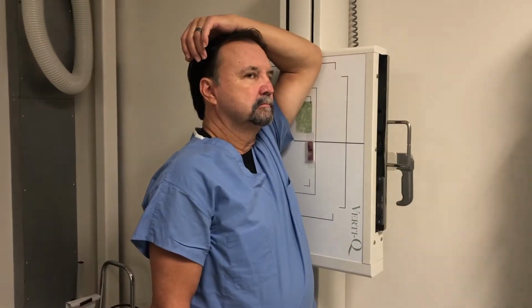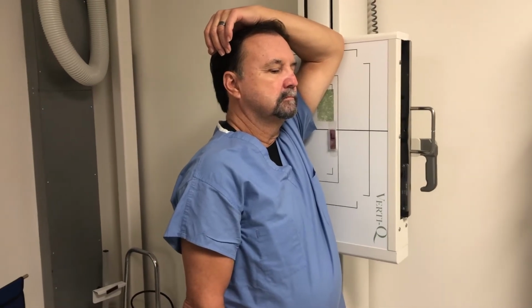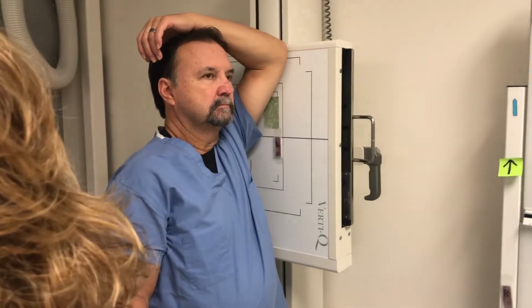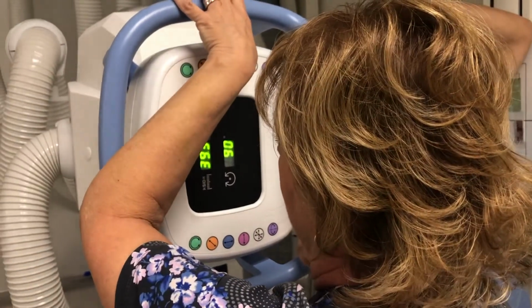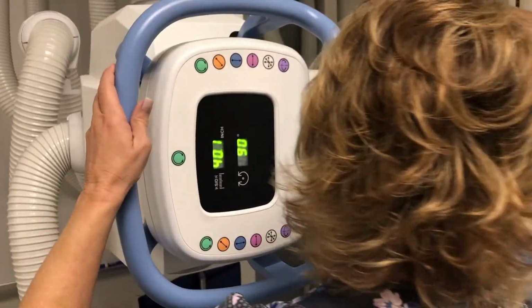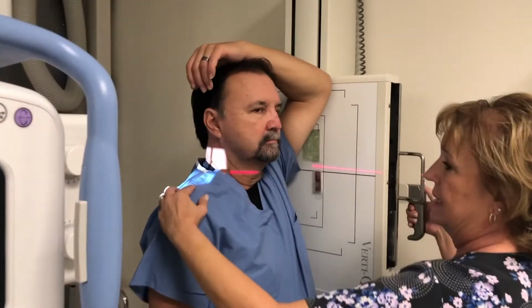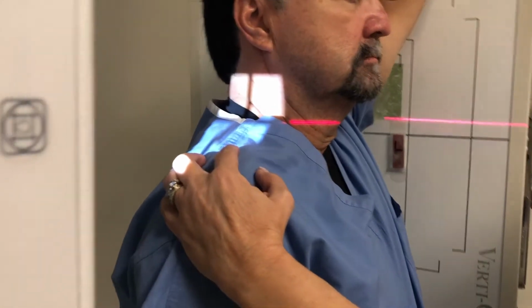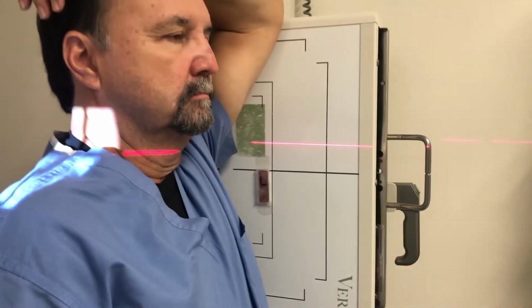I'm going to do this at 40 inches. And then if I needed to, I could put a slight caudal angle if I felt like his right shoulder was still in the way. It's going to be centered at C7, T1. If I'm at C4 right now, 5, 6, 7, I would want to drop it a couple of inches from that.